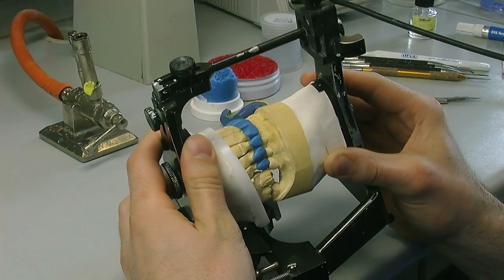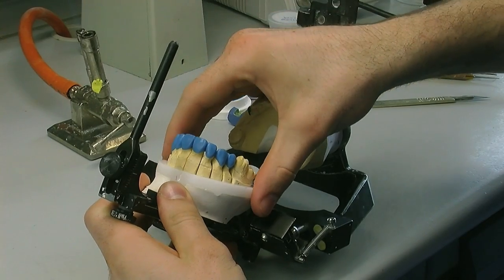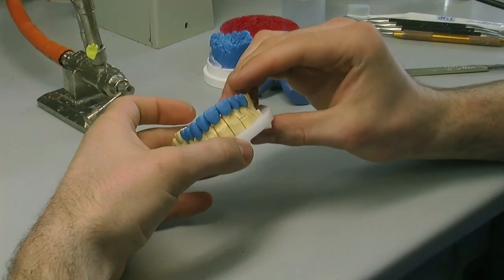Okay, so what we've done now is we've waxed the case up full contour. We used the putties to get the incisal edge position, which has been verified using a patient approved model. We've checked it on the articulator for excursions, and we've checked our occlusion. We're really happy with all of this.